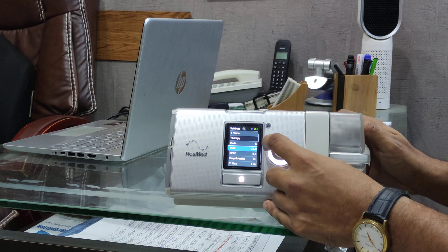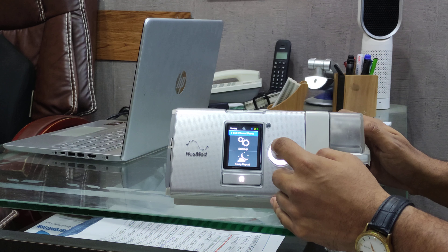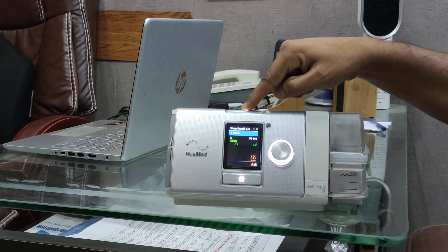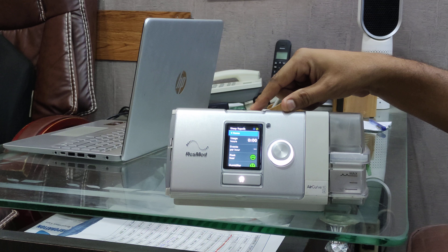Once you've done that, go to Home, click the button, and then exit the clinical menu. This is how you set the pressure. With this button you can turn your device on and off. Thank you very much for watching.